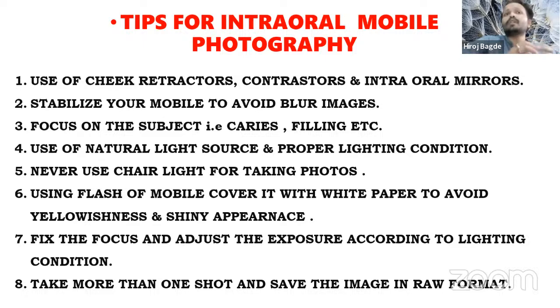Coming to the light option again, chair lights are not advisable, even for dental DSLR photography as well as for dental macro photography by mobiles. No use of any chair lights because they are harsh tungsten light. Their light range is not at the range where we want as a white balance. The white balance I told you is around 5500 Kelvin, so we need to have a light at that source.